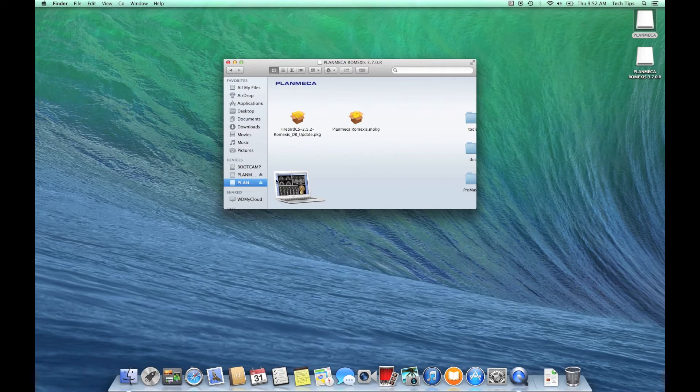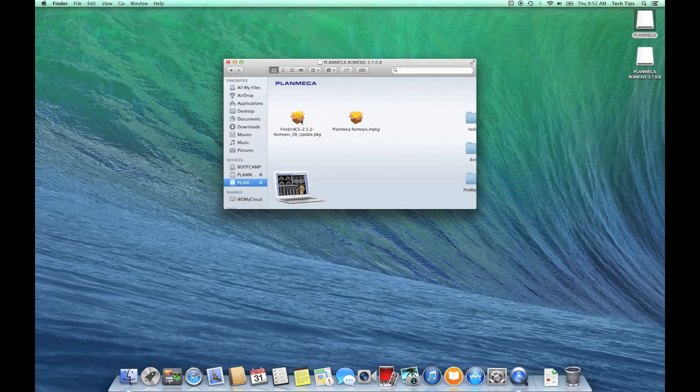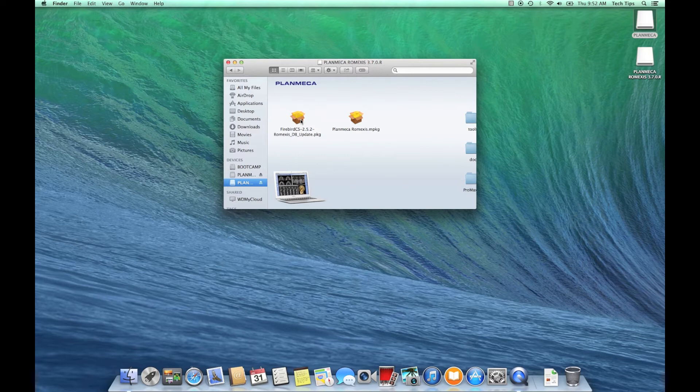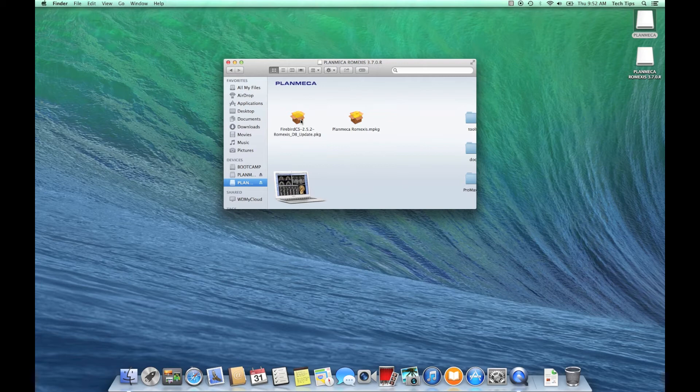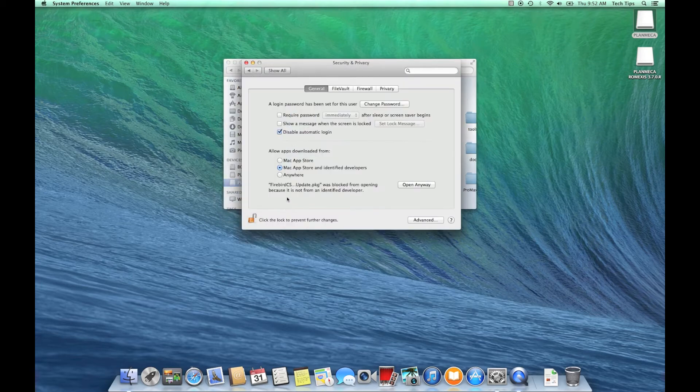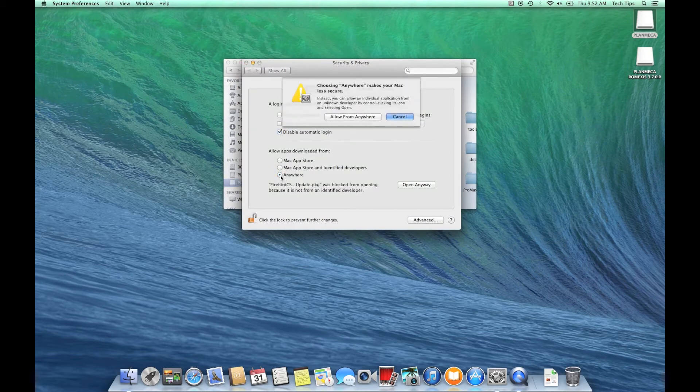Before we get started, this demonstration is going to focus on a server installation and we're going to install all the components just for the sake of demonstration. Later on we can talk about client installation components, server installation components, or capture computer components.